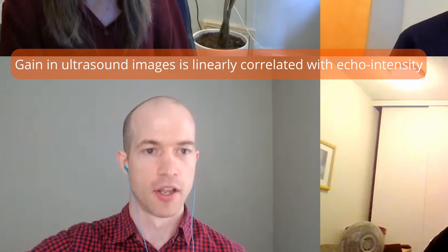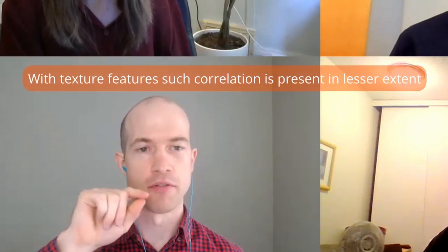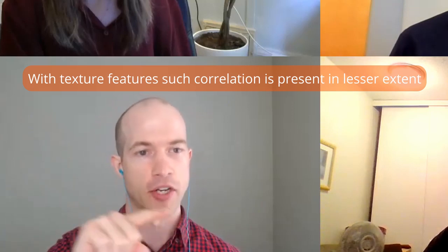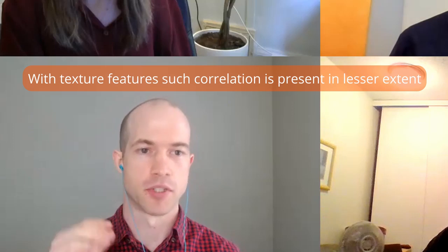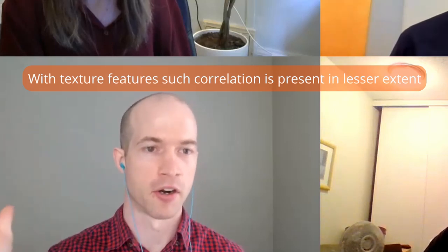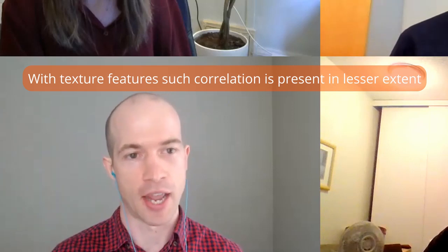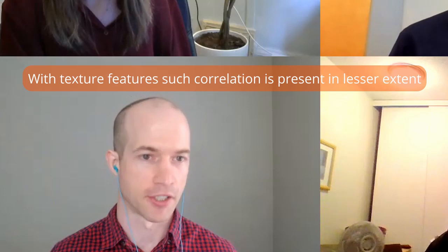It's increasing. Versus if you look at these texture features, as you increase the gain, there is an influence, but to a much lesser extent. Like there might be a 200% increase in your echo intensity with increasing gain, which may only result in a 10% increase in these texture features.